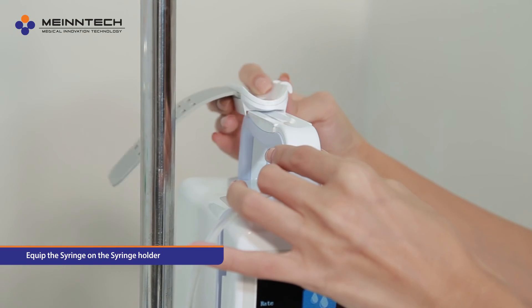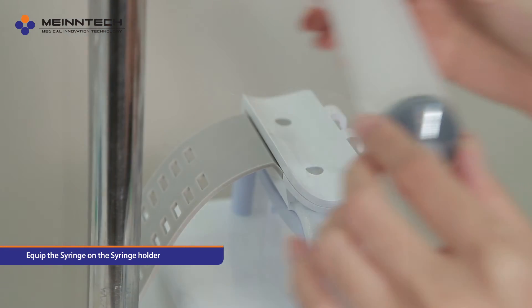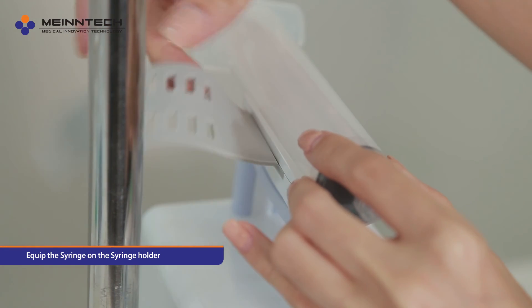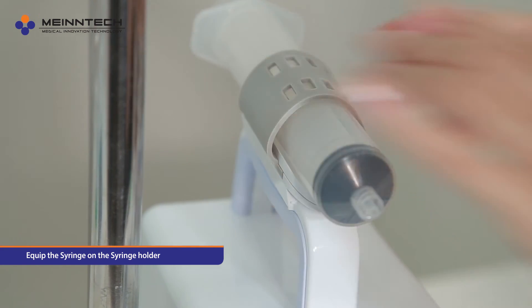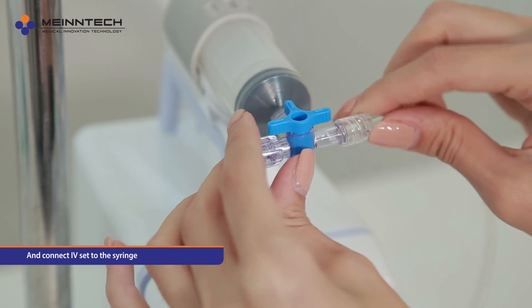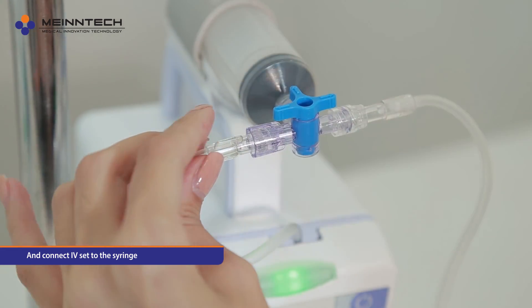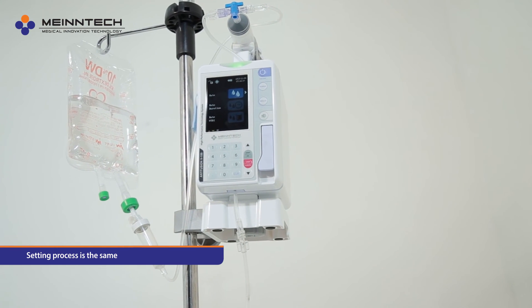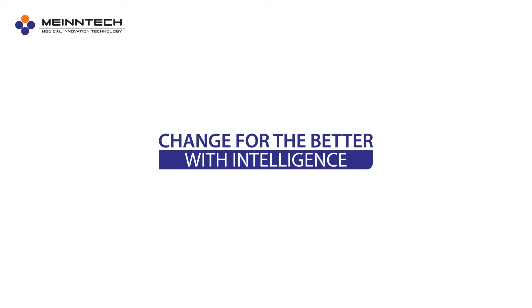Loading syringe: equip the syringe on the syringe holder at the upper part of the machine and connect the IV set to the syringe. The setting process is the same. Change for the better with intelligence.